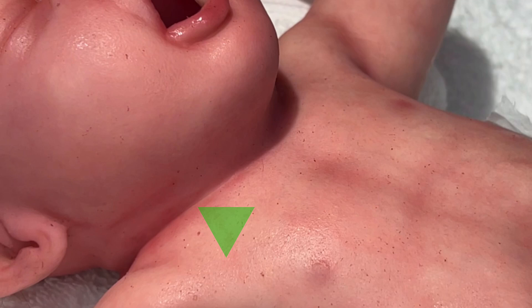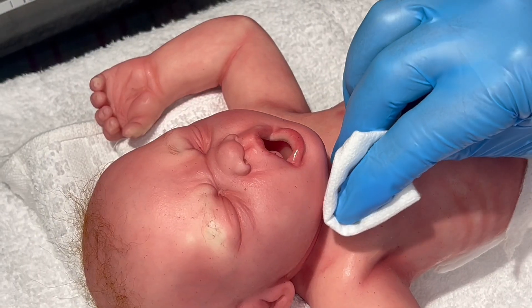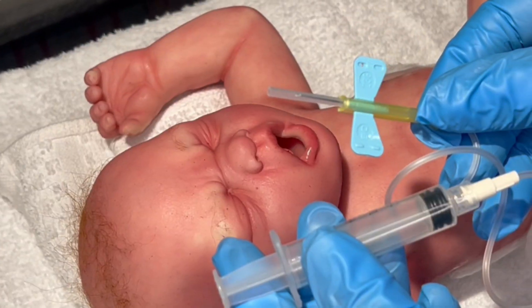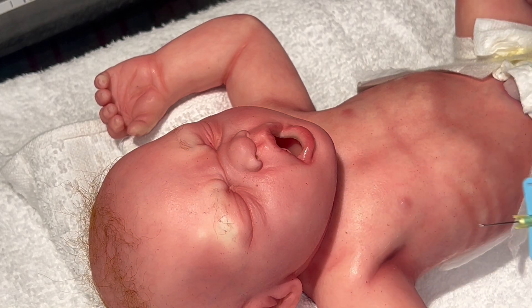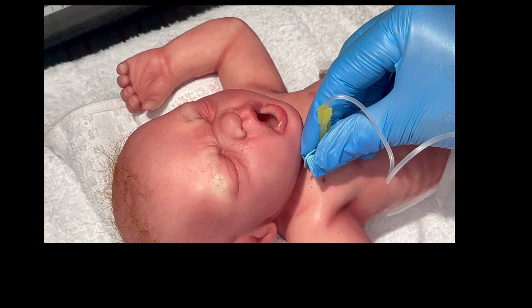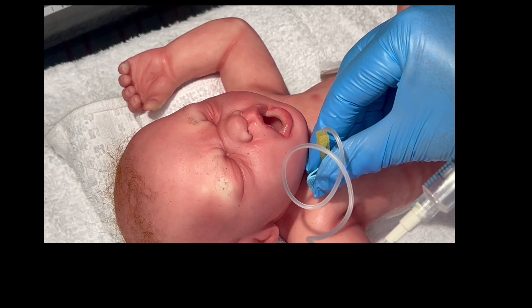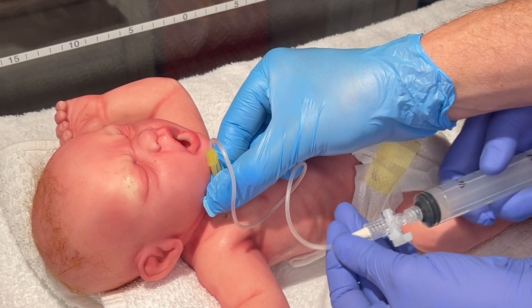The first demonstration will be the second intercostal space, mid-clavicular, on the right side. You begin by cleansing the site in a circular motion with a cleanser per unit protocol. Next, you take a gauze, wipe the site, and mark your landmark. Next, you'll take your butterfly and attach it to your 5-ml syringe. At this point, you can remove the cover from your butterfly and prepare for needle thoracentesis. Locating your landmark once again — second intercostal space, mid-clavicular — you'll enter the chest going over the rib at a 90-degree angle, pulling negative pressure on the syringe, and stop advancing when you see air in the syringe. At this point, remove the 5-ml syringe and replace with the 20-ml syringe attached to a three-way stopcock.